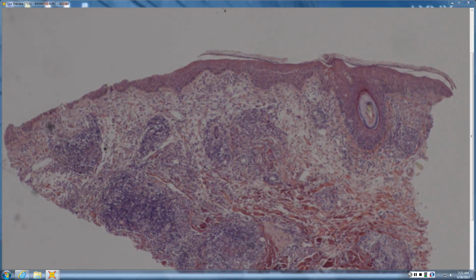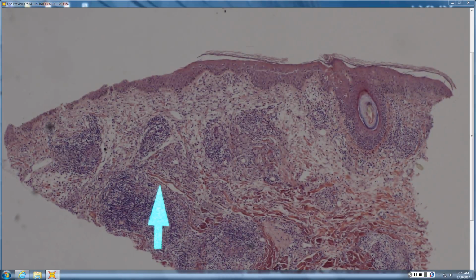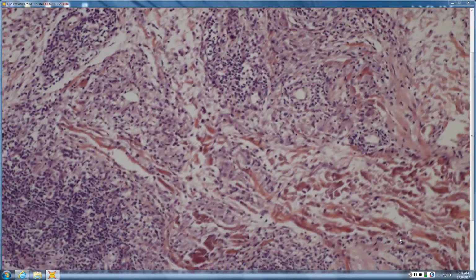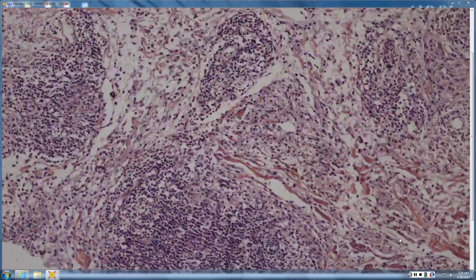Histologically, it's not a whole lot different than what you normally would see, except it's just a little bit more robust. So particularly on the lymphocytic ends, you're just getting a little bit more robust response around the vessels and nerves where all those organisms are. And you may start to lose some of the organisms as that cellular immunity starts to kill them off. But usually there's still some globi that remain and can be found with stains.